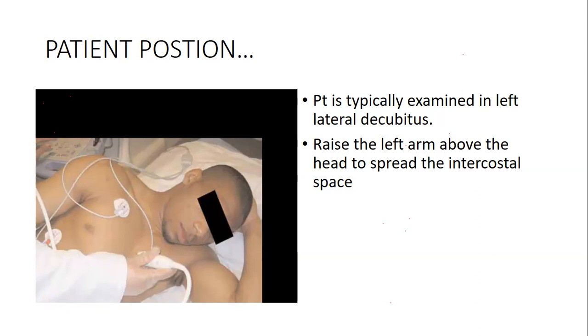However, by design, the cardiac probe normally has that small footprint, so even if sometimes the patient is unable to cooperate, you can still go through it. We also explained that we use a low frequency which has high penetration. Remember, the heart is seated deep in the chest cavity, so we spread the ribs so that we can see through the intercostal spaces.